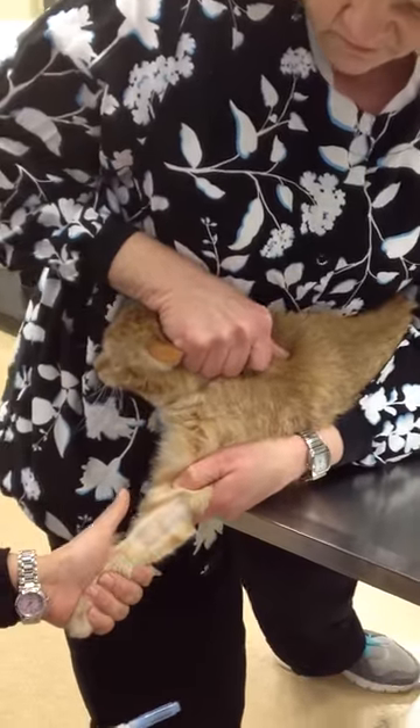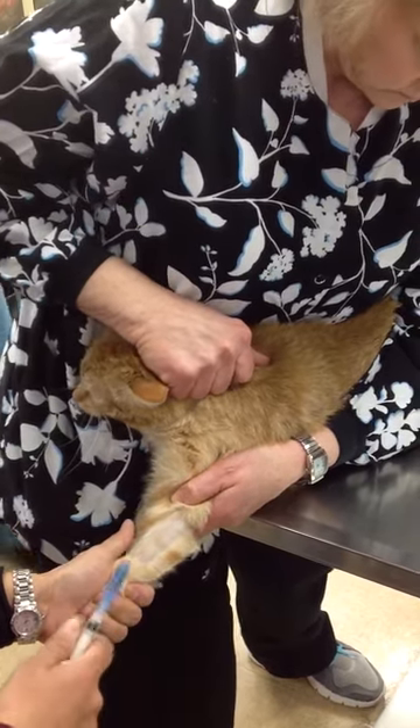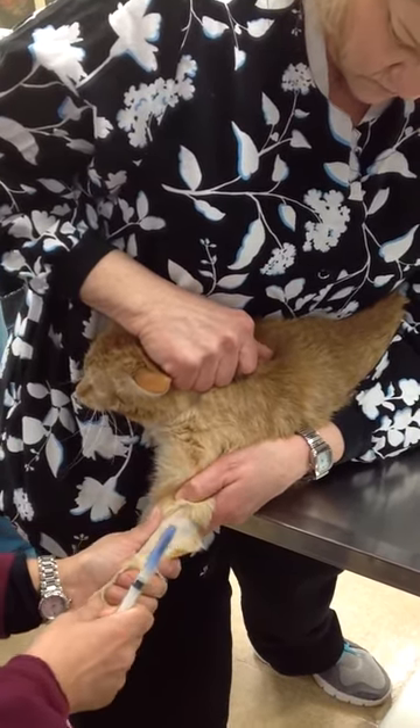Cephalic blood draw on a cat. Notice how Terry presented the limb. I grab the paw and I'm going to re-situate my hand.